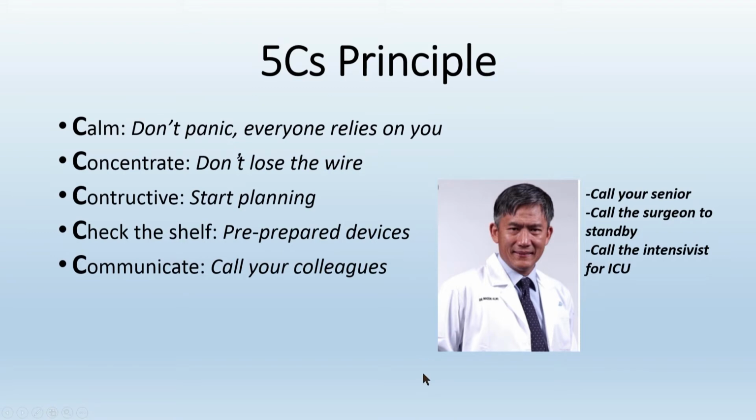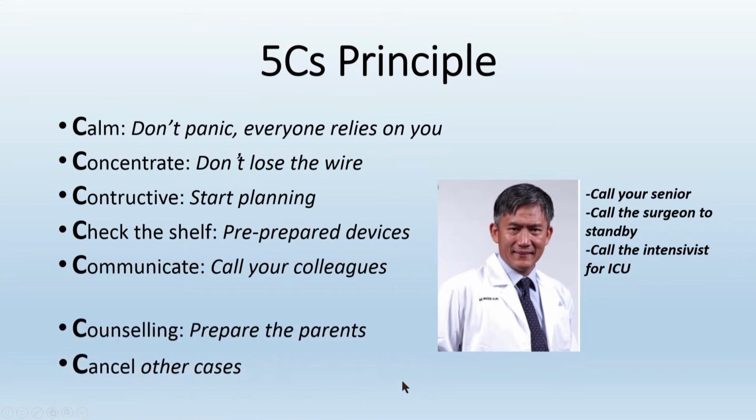Not only these 5 important C's, I have to add 2 more C's. Yes, you need to counsel the parents and prepare them for the worst case scenario. And the 7th C is also important: cancel the other cases, and concentrate on this case.